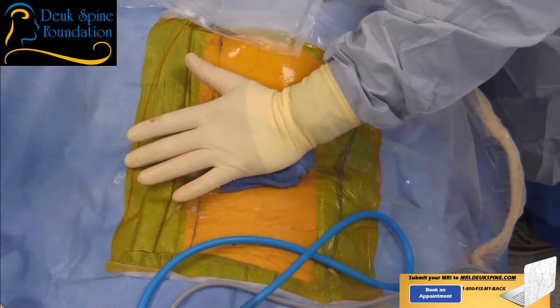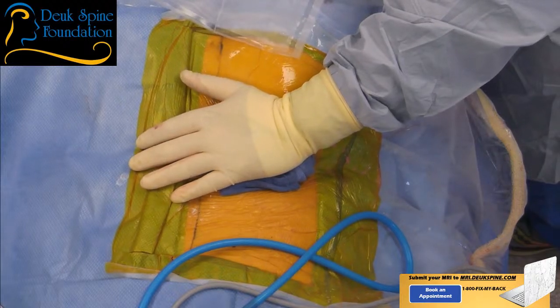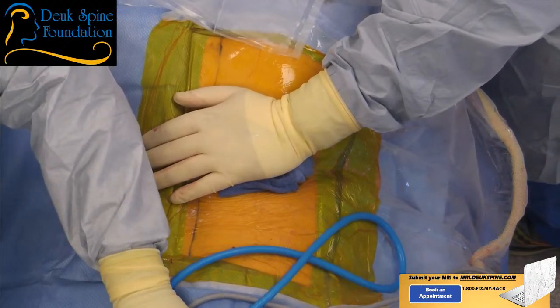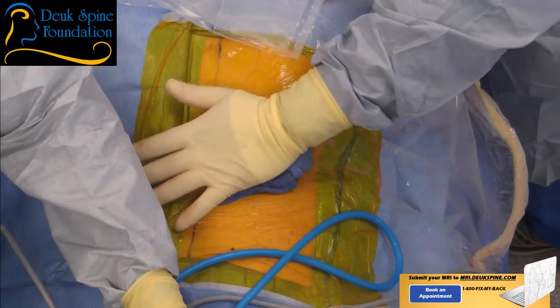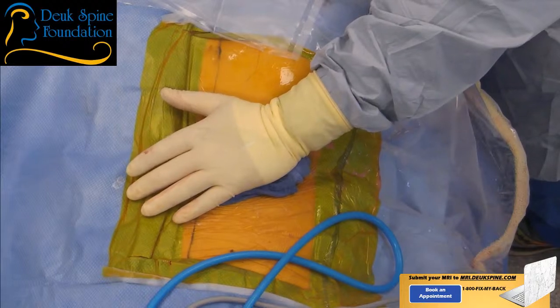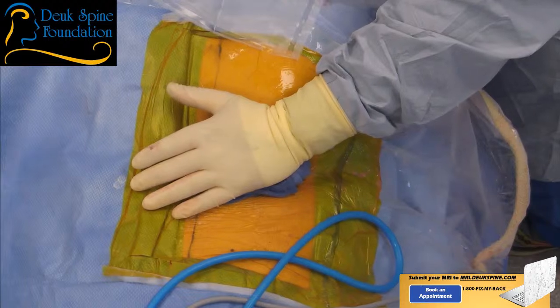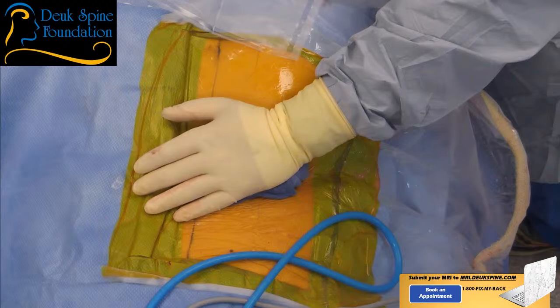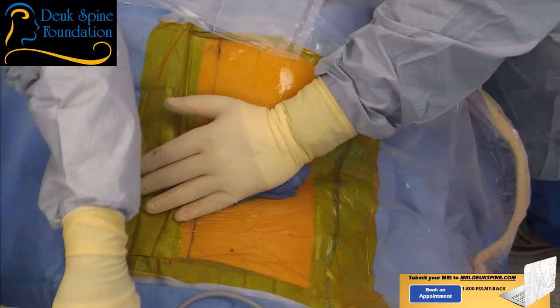And I'll tell you, the anesthesia is so important. Probably 8 out of 10 anesthesiologists I've seen and worked with in the past would not be able to get this patient to a level of stillness, not moving around, and relaxation where they're relaxed with their skeletal muscles to the level that I need to do this surgery. In other words, if the anesthesia isn't done right, there's no way I could have done this surgery. I've had other anesthesiologists in the past that we've tried out where the patient would be worming around on the table or tightening up their back and compressing the disc. And thank God we have a good anesthesiologist.